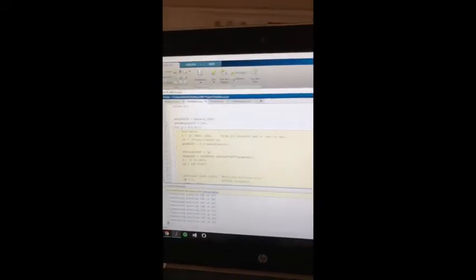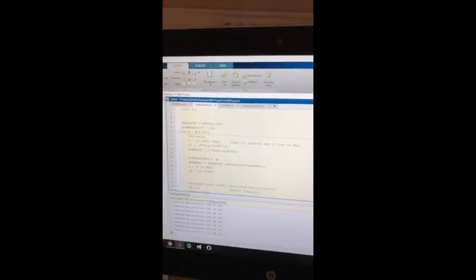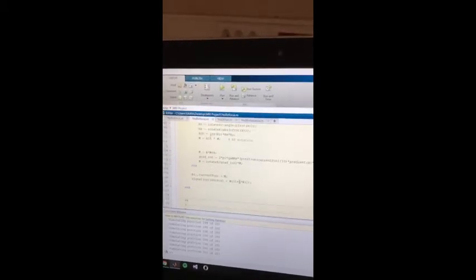Now the book says that the timing of this negative gradient should be half of the gradient, but this is just an approximation. They say this because they assume the RF pulse is a very narrow sinc. Now I will try to find the perfect value for it. For this, I took the code that I just showed without any refocusing, and I added a loop to it. Very simply, for values starting from 0 to 1 with 0.01 increments, I found 100 values. Now, what do I do with these 100 values?